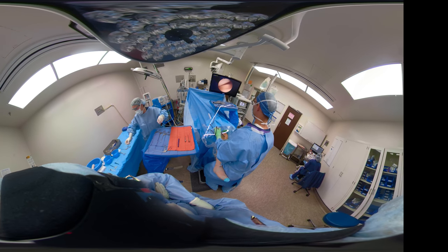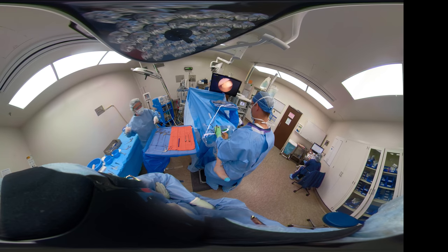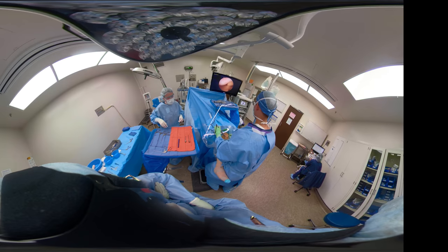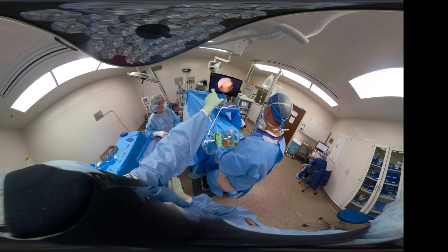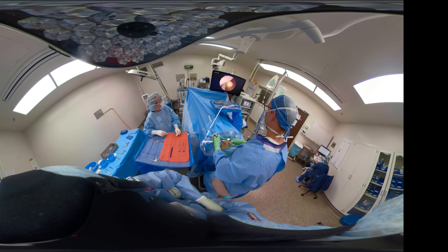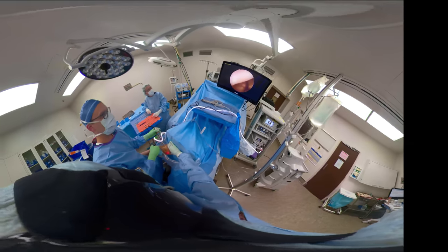Right knee arthroscopy. The third year resident is driving the scope. So you can see his left hand has the scope and he is probing the interarticular structures. And I'm explaining what to do. This is an individual that had an osteochondral fracture with a loose body that came off his lateral femoral condyle.